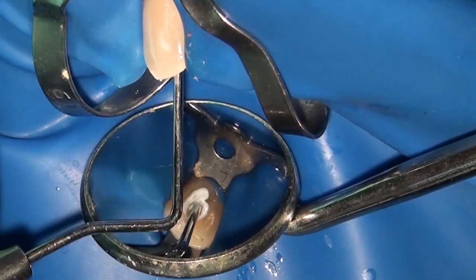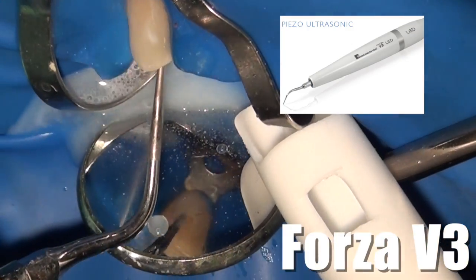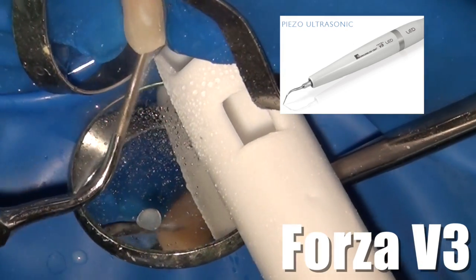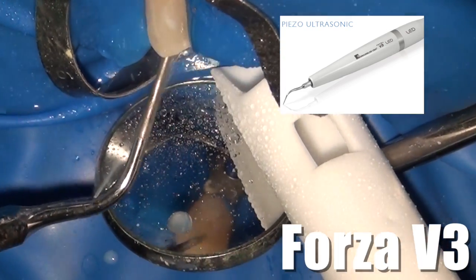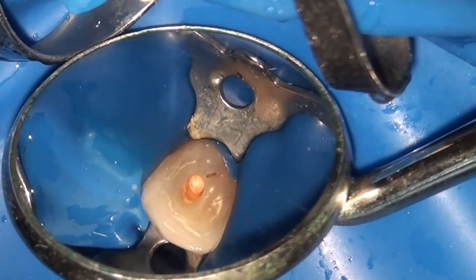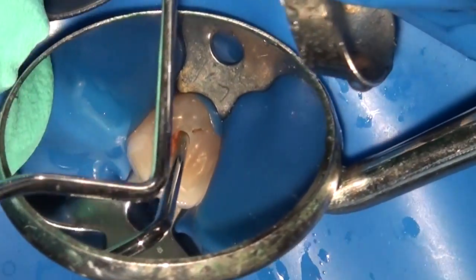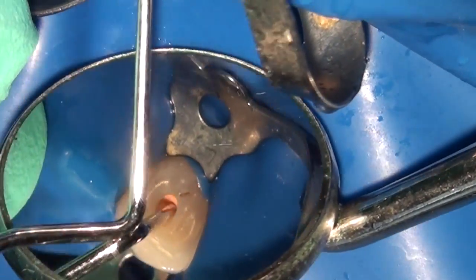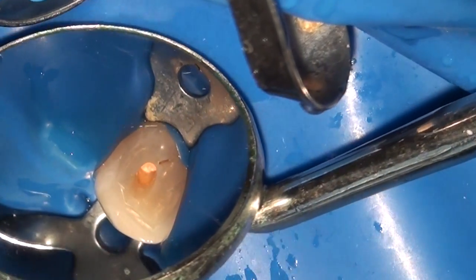Make sure you're covering the whole orifice with gutta-percha so no sealer rim remains around the orifice. Condense methodically using light pressure with a size 10 condenser first, then move to a smaller size 9 and even size 8 if necessary — the goal is to walk the condenser around the margins. Once adequately condensed, remove excess sealer with the ultrasonic and water, making sure not to touch the gutta-percha with the ultrasonic tip — only touch the walls of the chamber. Then do one final round of condensation with the size 10 and size 9 plugger.